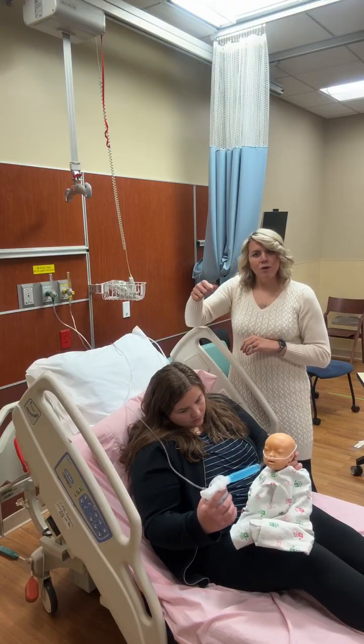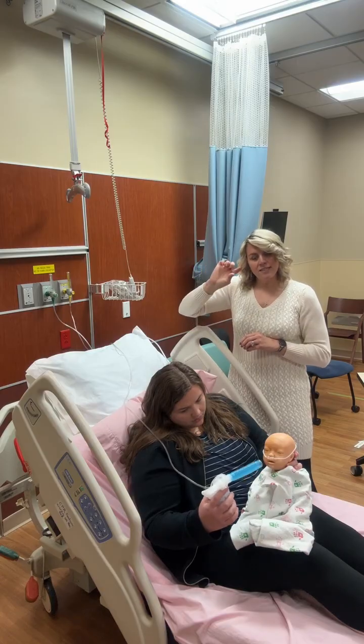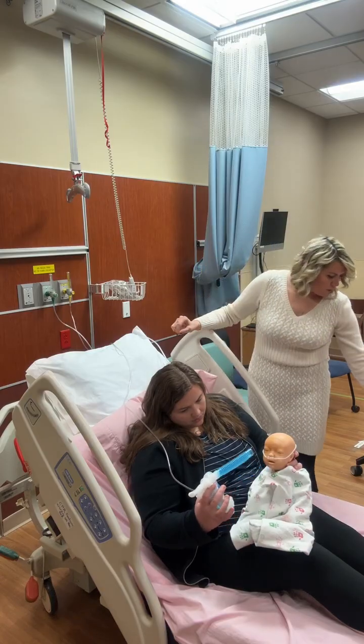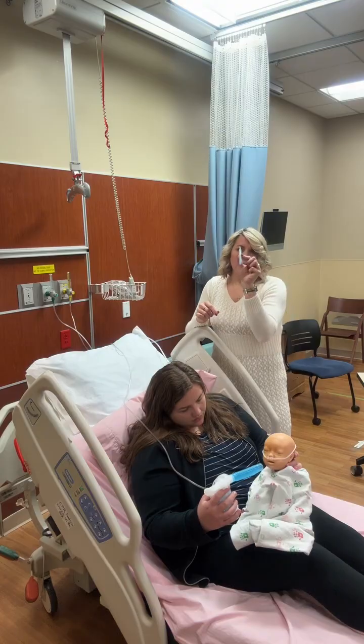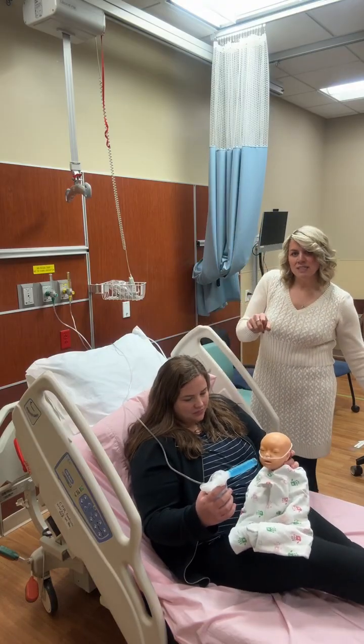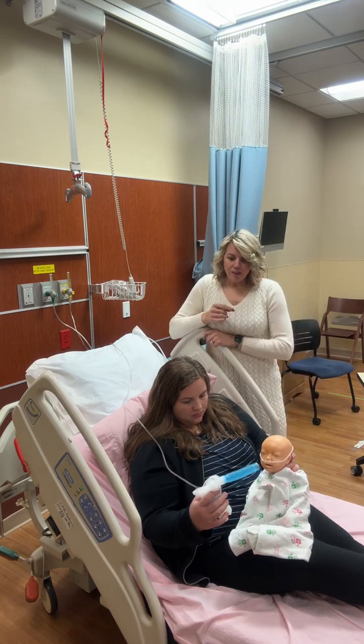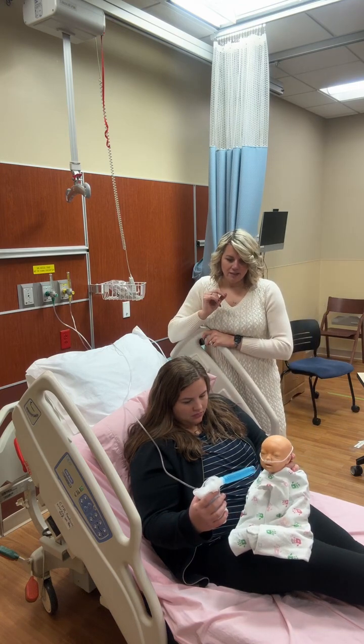Sometimes I might tell mom, go ahead and shake it a little bit so that some of the bubbles might get stuck on the sides of the cup. For the purpose of this video, I only put half of the liquid in there so that I could have you listen to what it sounds like when it nebulizes all the way. So I'm going to stop talking here for a second.